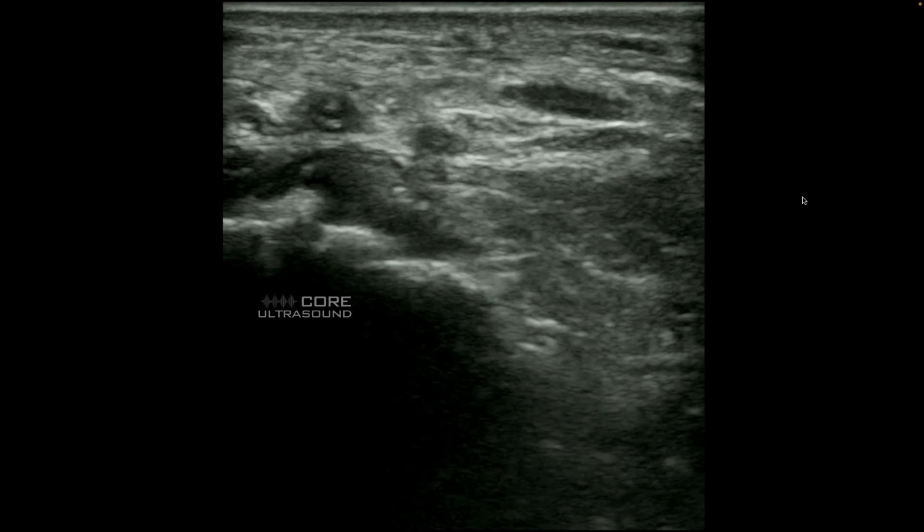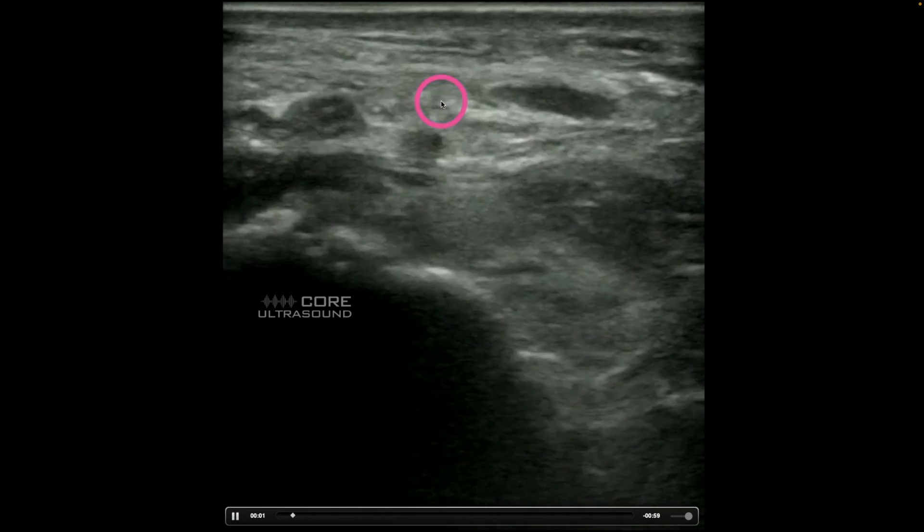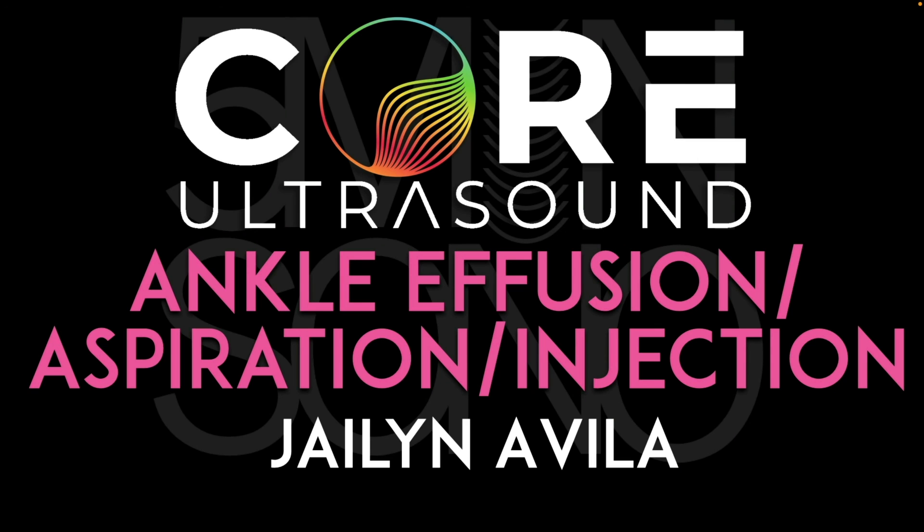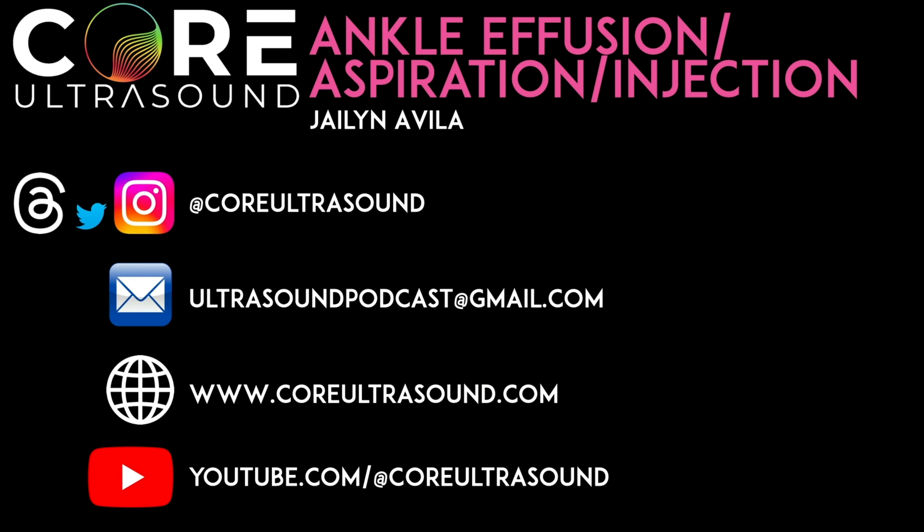One structure to be careful of is the dorsal pedal artery — you definitely don't want to pierce that. Sometimes what I'll do is place the transducer transverse over the ankle joint to identify the dorsal pedal artery, which you can see right here, and you can see that I'm approaching that joint space while avoiding the dorsal pedal artery — which is definitely what we want to do. That's it for this Five Minute Sono lecture on ankle effusion, aspiration, and injection. I hope to hear from you soon, and happy scanning.